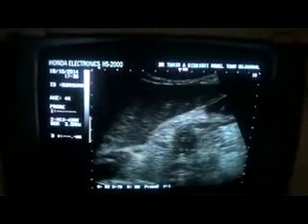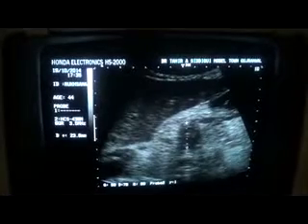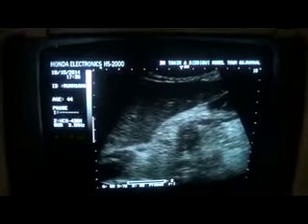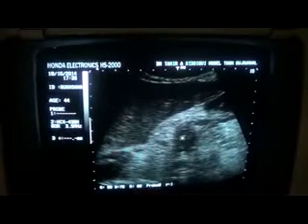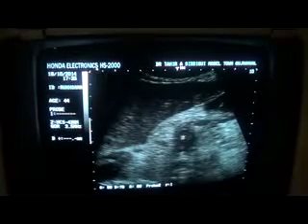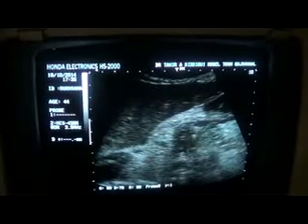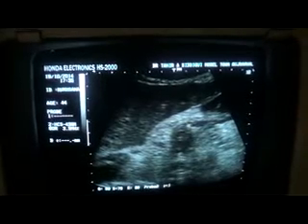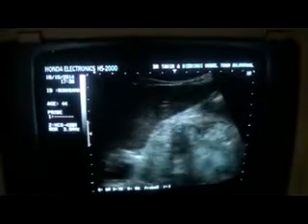No pathology seen relating to it, measuring approximately 2.3 centimeters with this depth seen within the center, and there is no dilation of the duct. There is no focal mass lesion, no calcifications are seen relating to the pancreas that we have seen so far.